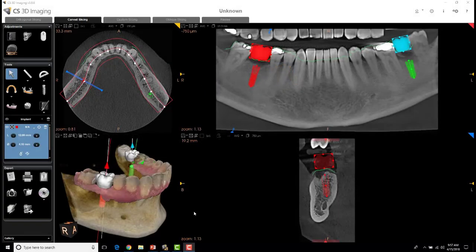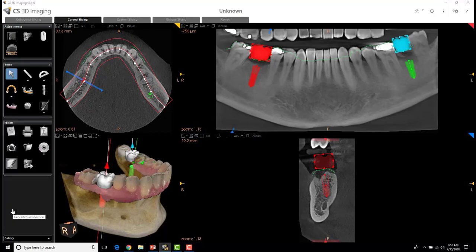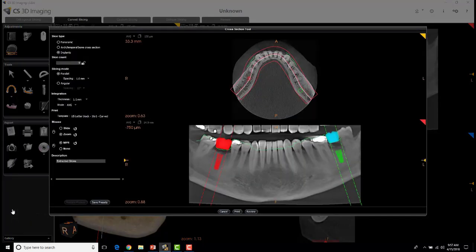I wanted to cover a feature that I really don't think is used enough — the generate cross-section tool. I'll show you a couple ways you can use it. The first is if you already have your implants planned, you can simply hit your cross-sectional tool and you'll see a few different things.